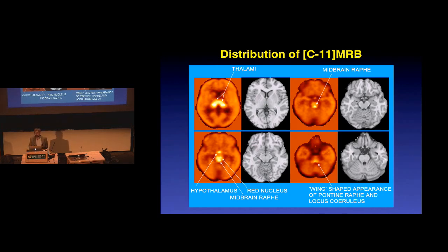These are extremely small structures in the midbrain, and by having the ultra-high resolution scanner, better than what's normally available clinically, we are able to ask this. But it really poses a lot of technical imaging questions. How do I measure this reliably across subjects?